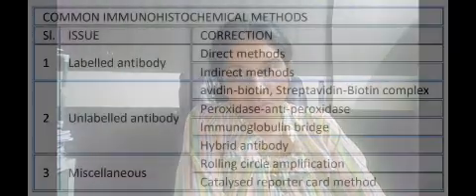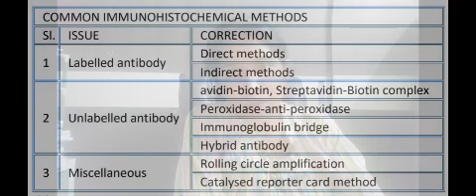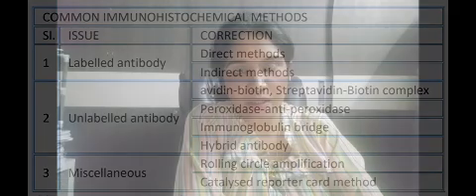So yesterday we were discussing primary antibody binding. The further steps after this depend on whether you use a direct methodology of detection, an indirect methodology of detection, or an unlabeled methodology of detection.